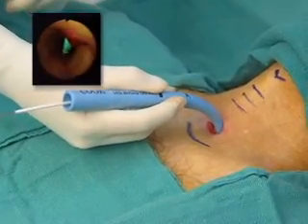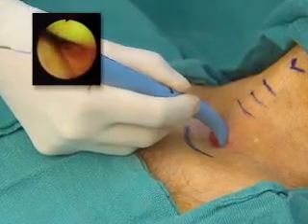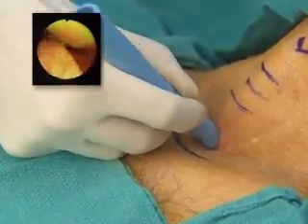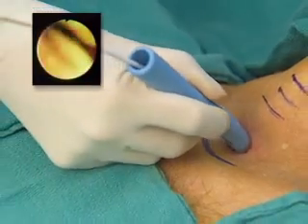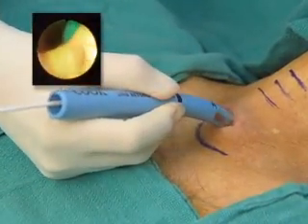The dilator is held like a pencil and advanced with a curved arcing motion into the trachea until there is a loss of resistance. Repeated advancement and retraction of the dilating assembly effectively dilates the tracheal access site. The aperture should be slightly over-dilated, thereby facilitating the placement of the tracheostomy tube.